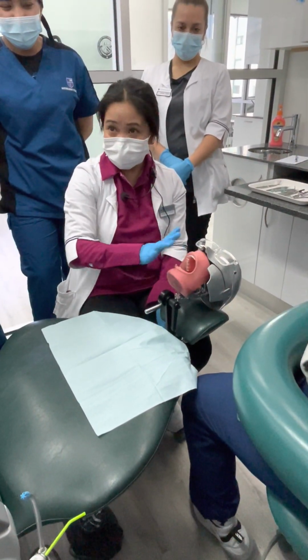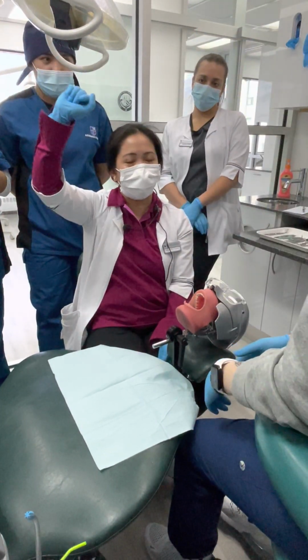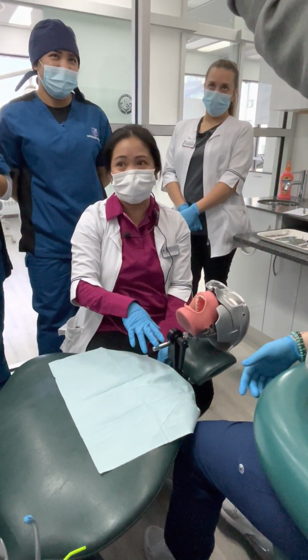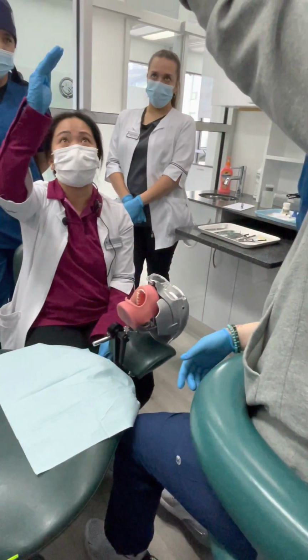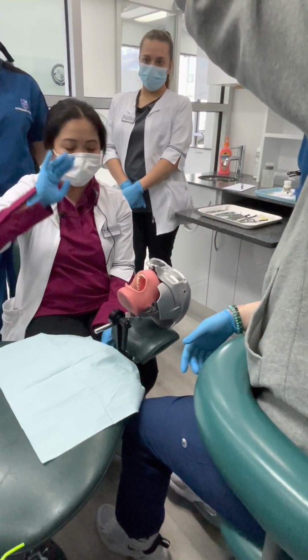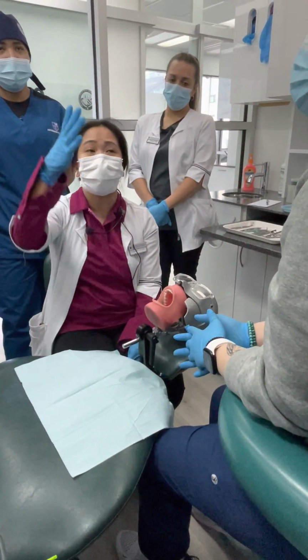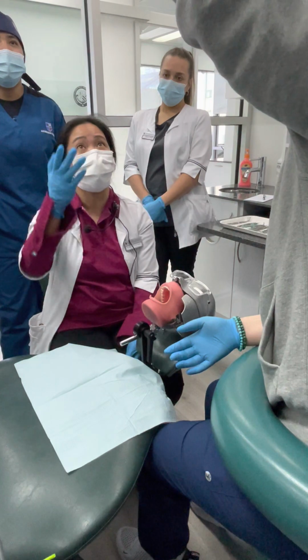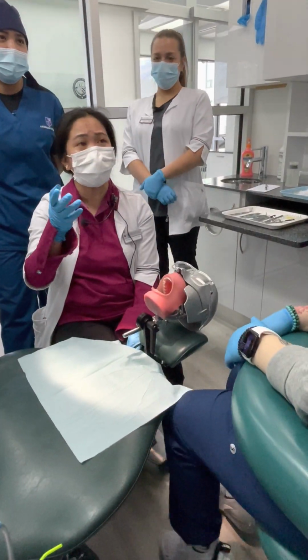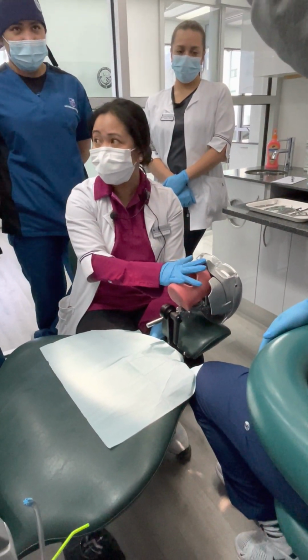Okay, so the patient is properly seated. You adjust the light. The light should be at least one elbow. Stretch your arm all the way up. Not there, here, because you don't want it to be on your head, or you're going to knock it on your head when you're adjusting yourself to see the mouth properly. Don't worry about me, because you're the one adjusting it anyway. When you turn it on, the light should be positioned on the chest of the patient first. Turn it on, because you have to remember, it's a voice command. Say it: turn on. There you go. It's okay. On the chest. So it will always be on the chest first, and then you adjust it depending on what quadrant, on what arch we're working on.